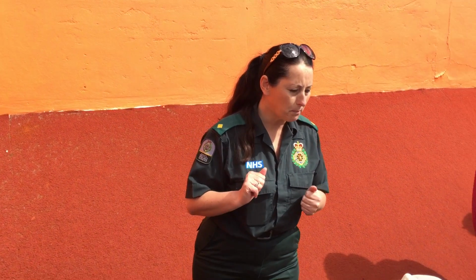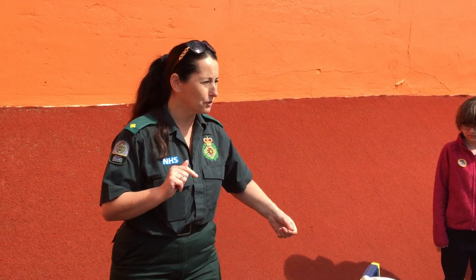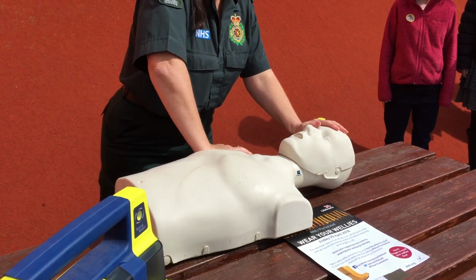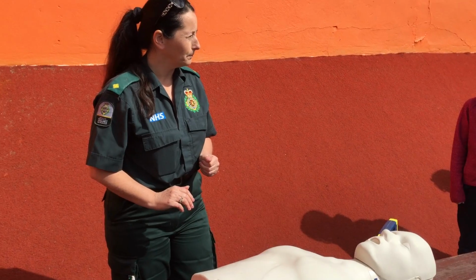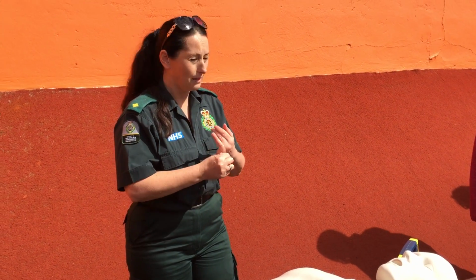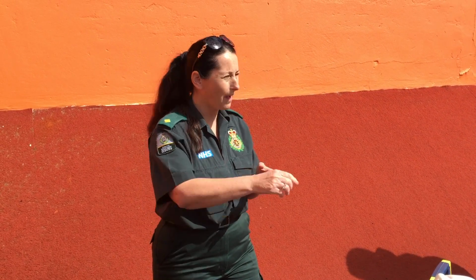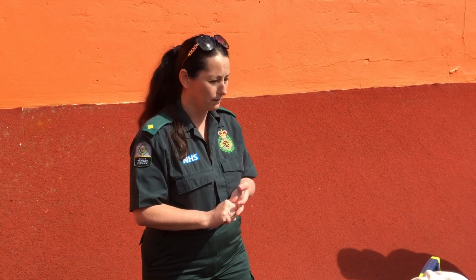Response. So you can do that two ways. So hello, can you hear me? Open your eyes. So there's no verbal response, so now I'm going to try pain response. So you can press quite hard down on the shoulder. Hello, can you hear me? Open your eyes. There is no response to pain. So I'm going to shout for help. Dial 999 if nobody's already done it, and also if there is a defibrillator, then they can direct you to that, or if it's here, you can call somebody to get that defib for you, because there is one here.